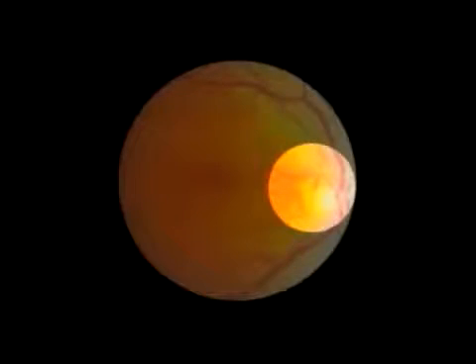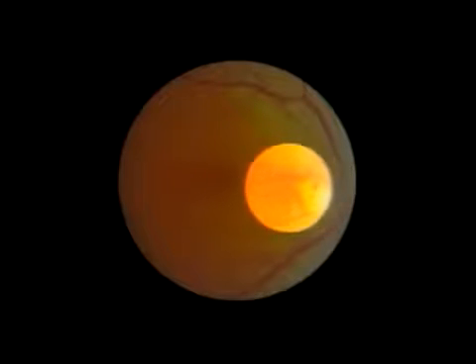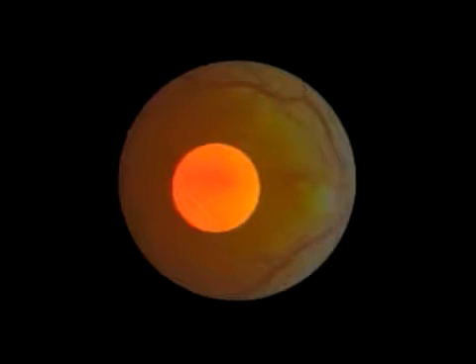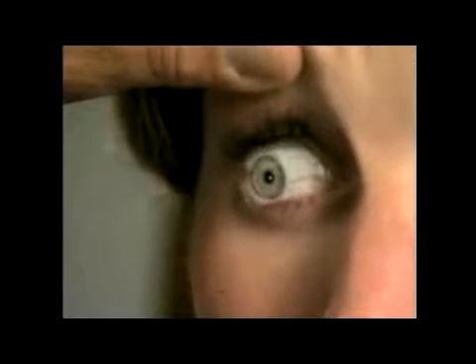To find the macula, focus on the disc, then move the light about two disc diameters temporally. You may also want to ask the patient to look at the light of the ophthalmoscope, which will automatically place the macula in full view. Many practitioners choose to use the red-free filter at this stage to facilitate viewing of the center of the macula.